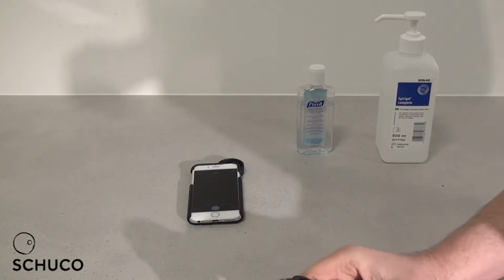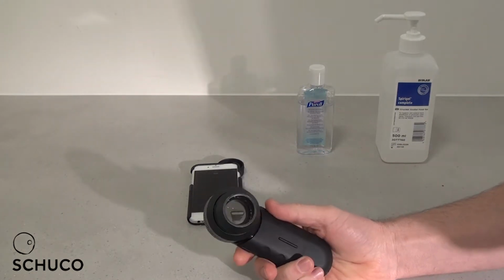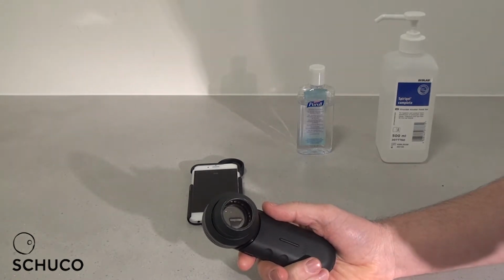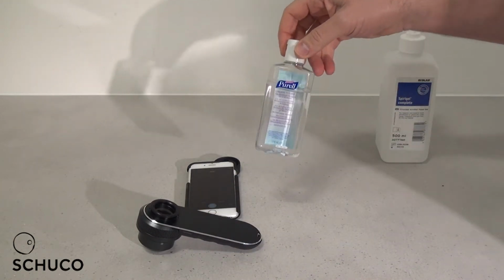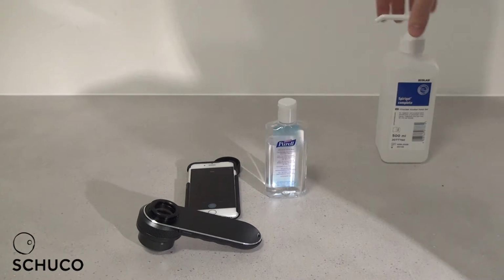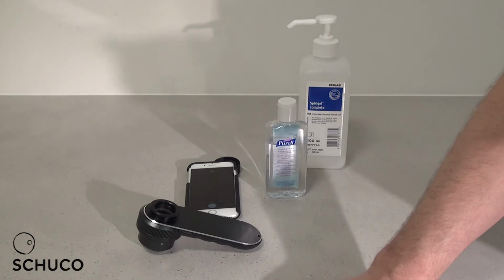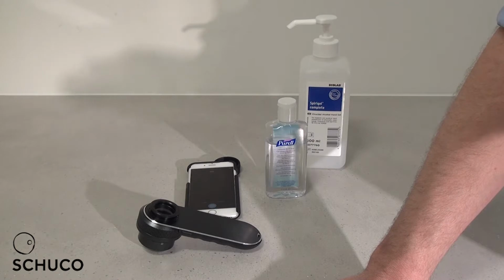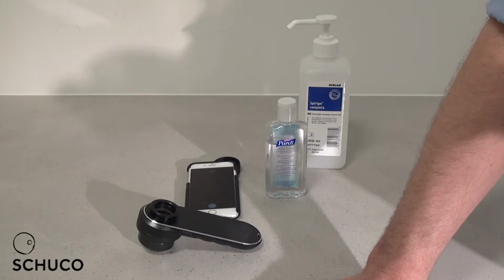The next stage is actually taking the image itself. When you're using non-polarizing dermoscopy, you do need to use a contact medium to apply to the actual top of the dermatoscope. I would suggest either using alcohol gel or Spirigel, as this both acts as a medium but also cleans the dermatoscope after use. If you're using it in sites close to an eye or an open wound, then it's probably best to use ultrasound jelly, as this won't sting the patient.